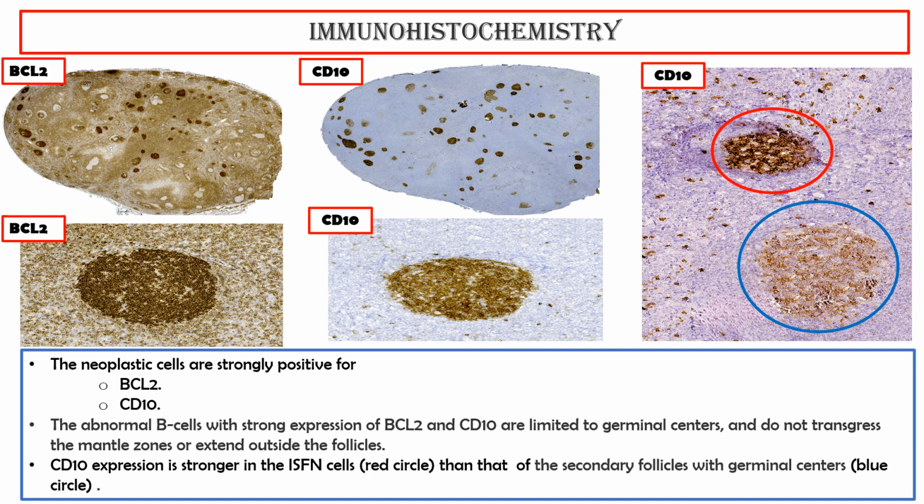CD10 expression is stronger in the in situ follicular B cell neoplasm cells, red circles, than that of the secondary follicles with germinal centers, blue circle.